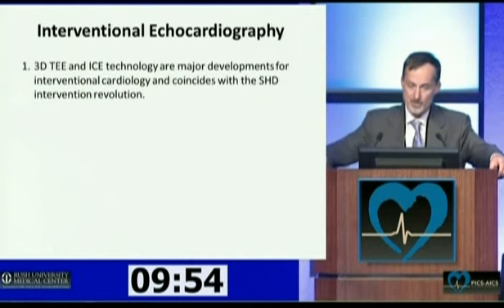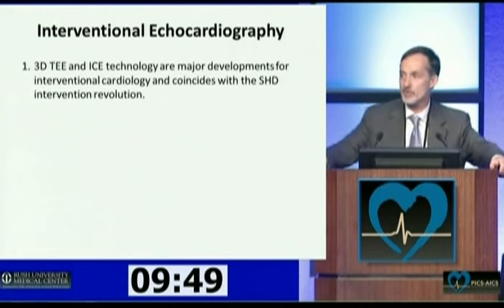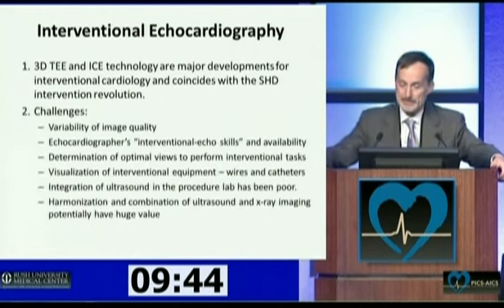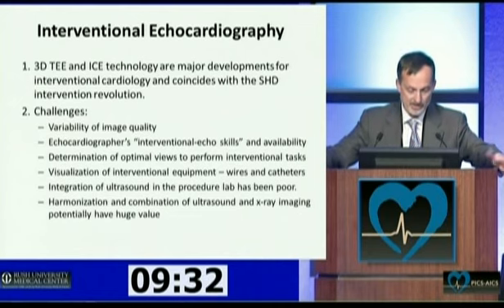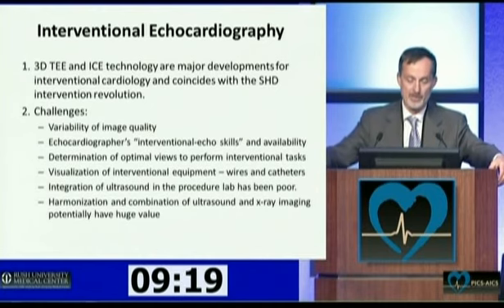So interventional echocardiography has two major technology components, 3D TE and ICE technology, and it's come along. But there are certain issues that remain. Number one, we've all seen the variability of image quality, and we're used to, in these presentations, seeing the best, selective best. Secondly, we know the way echocardiographers have really evolved in the last 5 years to embrace this major new frontier, and some have made that transition, some have not.